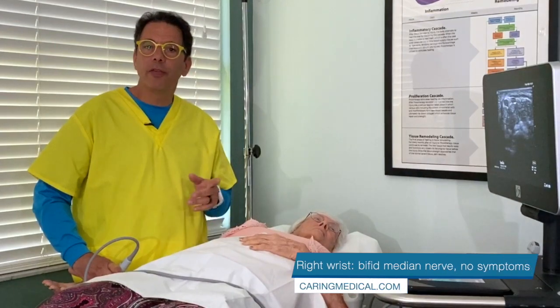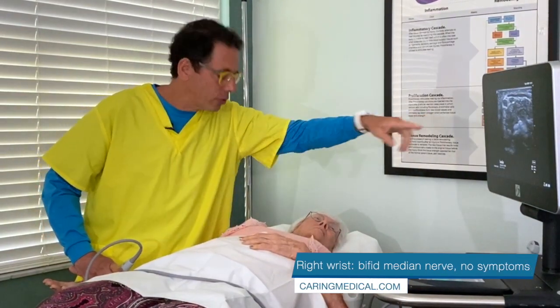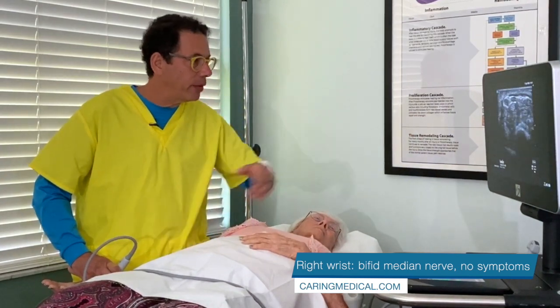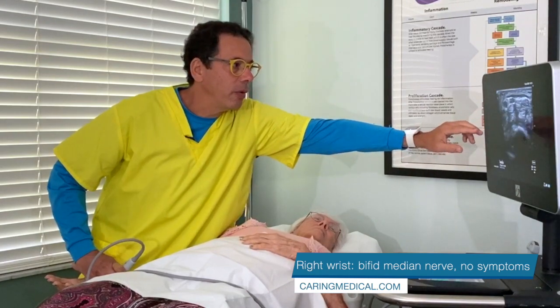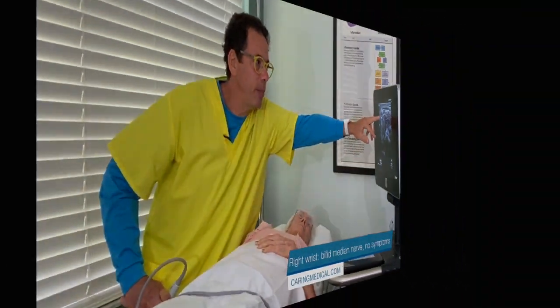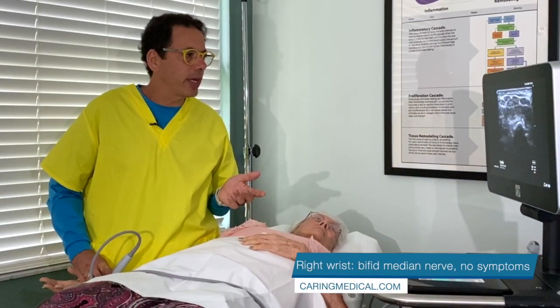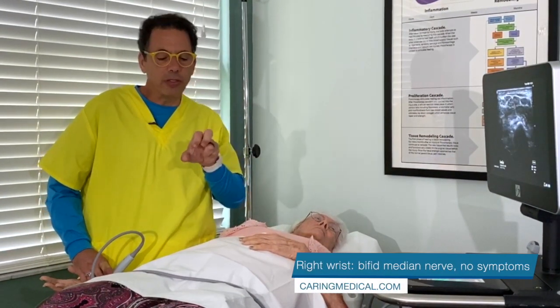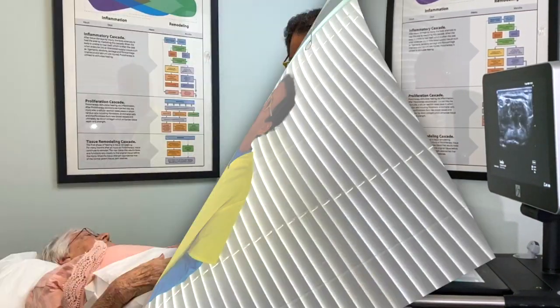The median nerve in the wrist normally stays together, but we see on this ultrasound in Patti's right wrist that it's actually been divided. So here's the two branches of the median nerve. So a bifid median nerve occurs in anywhere from like 3% to 20% of the population. I kind of use about 5%. In her, this branching of the median nerve isn't causing any problems.